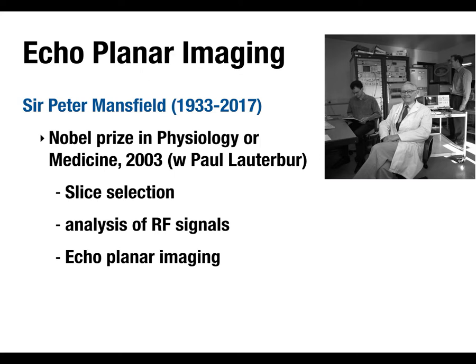What's particularly interesting is that he invented it decades before anybody could actually do it, because the MRI hardware at the time wasn't capable of doing it. It took decades for the engineering to catch up with the theoretical side of what he had invented. The Nobel Prize was for the slice selection, developing the method of slice selection using gradients, the whole approach of using magnetic field gradients, and also analysis of RF signals.